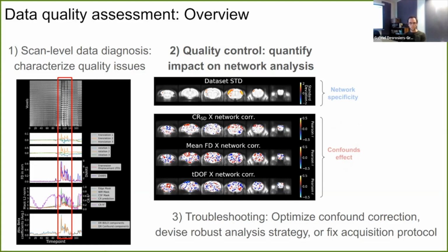I guess as a follow-up, if we're interested in looking at group differences down the line, as a lot of our projects are designed around, depending on what kind of model we're looking at, I could imagine that there could be differences within the mice, even in the scans, or in what kinds of artifacts appear.